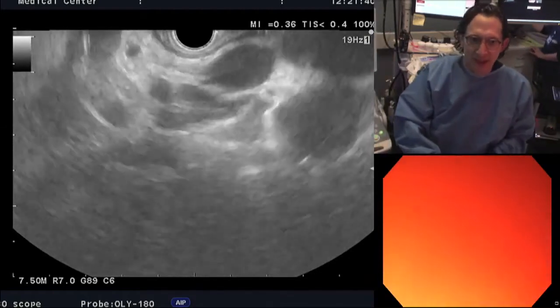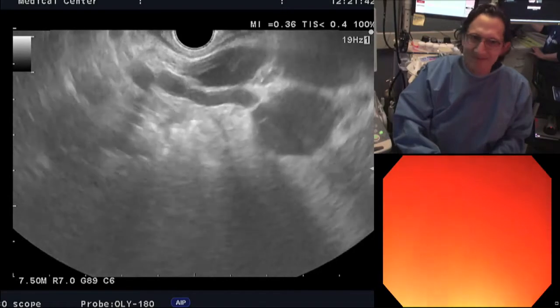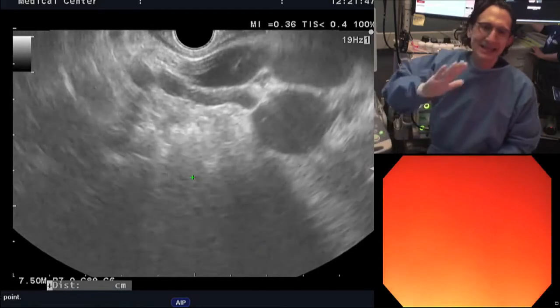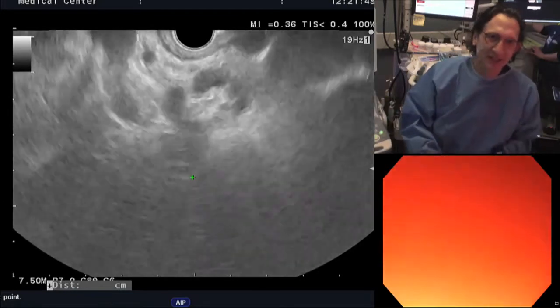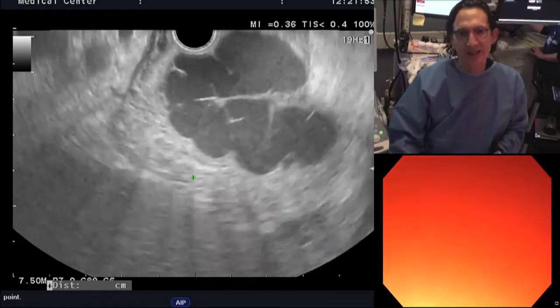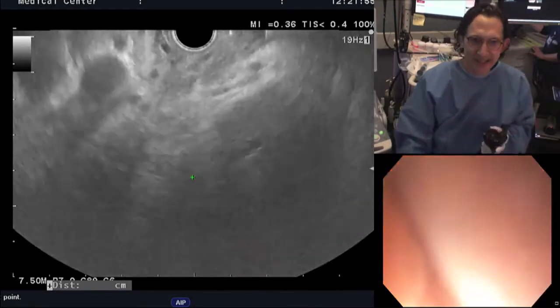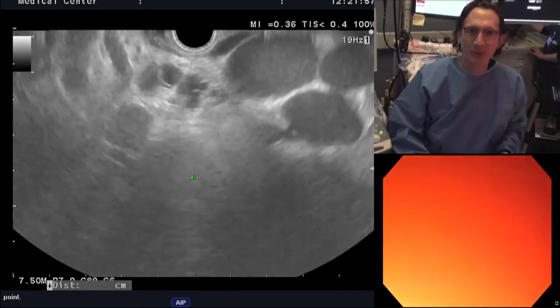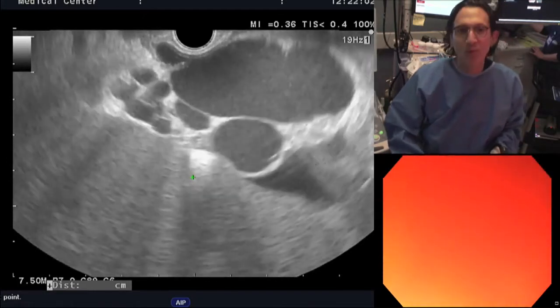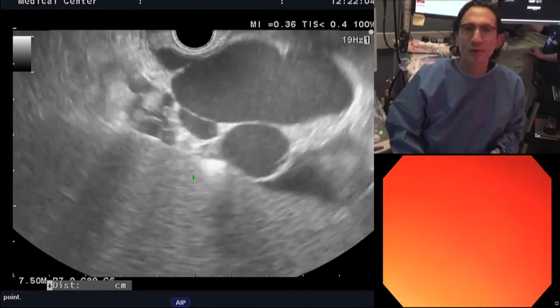Maybe here. There's something that seems to shadow a little bit there. Maybe if you look here. All right, so regardless, I think we can treat this here. This is intramural. This here is extramural. We don't want to touch this. If you try to put a coil in here, it'll swim away.